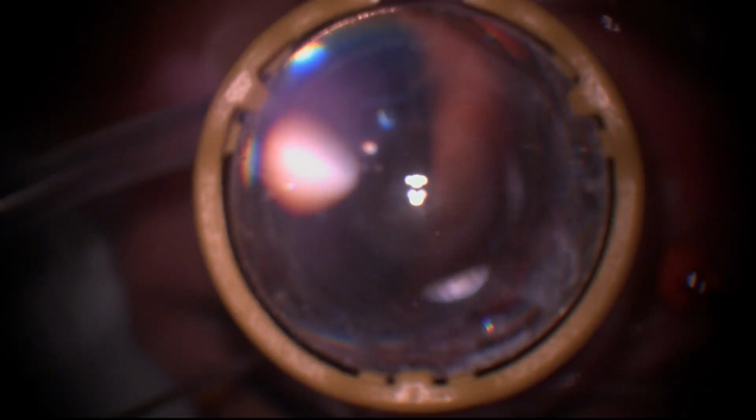Now this is the effect which you will see in winters. You will see the deposition on the lens. This is vapor being deposited, condensation because of the patient's surface evaporation and breath coming from the nose. Open his nasal channel. So if you don't allow the breath to go there, it will come here and it will get condensed over the lens. And it will cause recurrent poor vision.